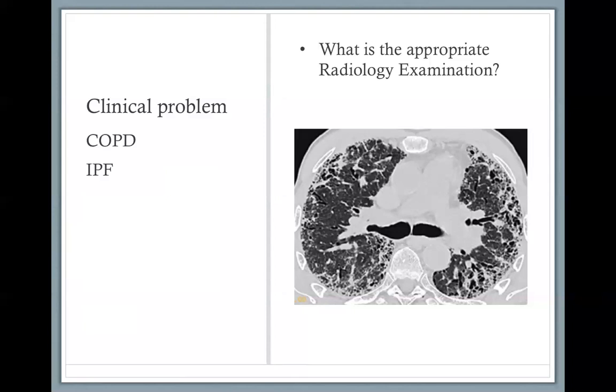It's unlikely to go to CT without doing a chest X-ray. I'm talking just about the chest. I mean, we do CT abdomen without an abdominal X-ray all the time. We do a brain CT without a head X-ray. But when it comes to the chest, it's very unlikely to do CT chest without an X-ray. But the most important thing is, if you start with something and it will help you to answer the question, you can stop at it, or you can go to something that is more advanced.